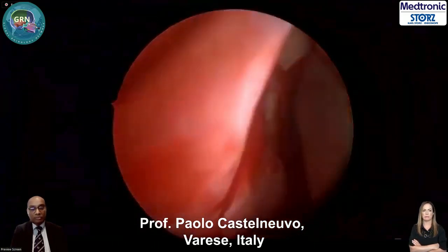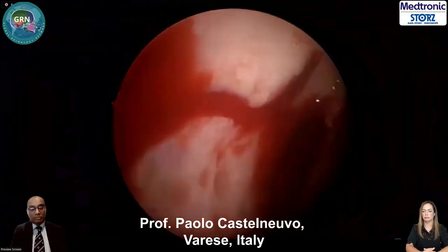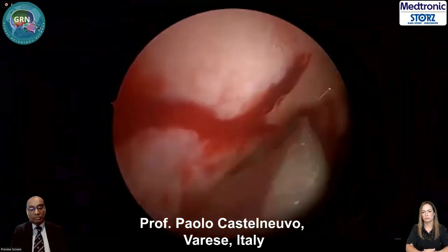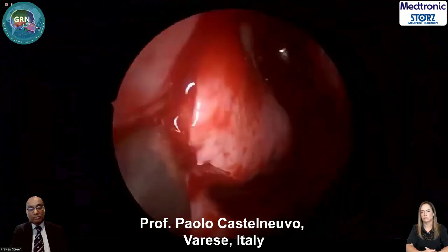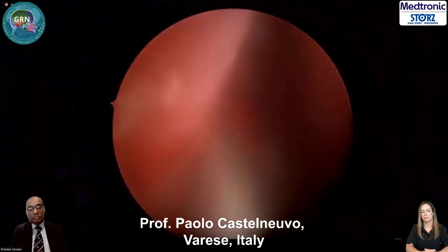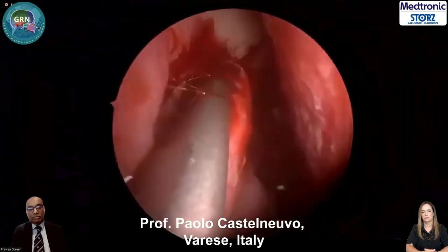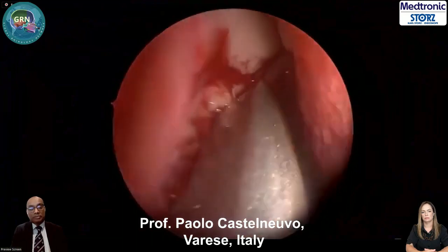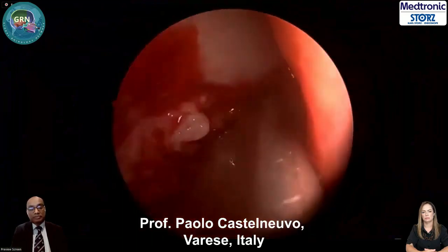So we have done the landmark for the procedure. This is the axilla of the middle turbinate, lacrimal pathways, and this is the head of the inferior turbinate. Okay. Then we make this section.